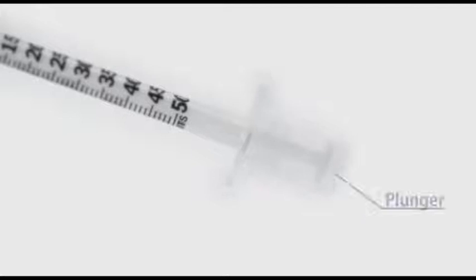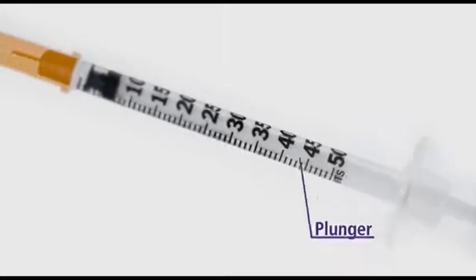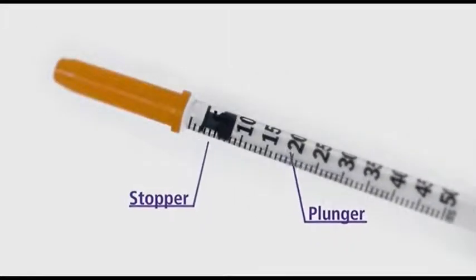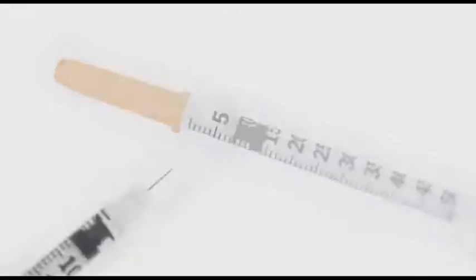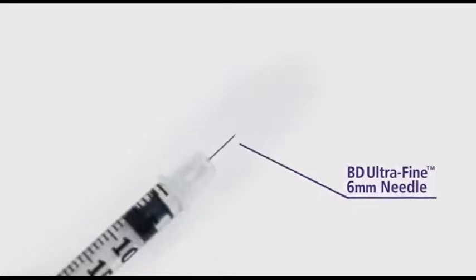A white cap covers the end of the plunger. Inside the barrel, the plunger has a black rubber stopper that moves as you push or pull the plunger. At the other end of the syringe is the needle, which is covered by an orange cap.